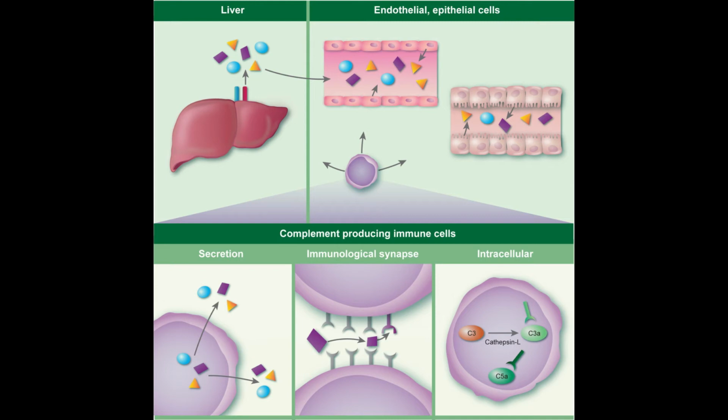The test involves a two-stage process: a test system with antigen and antibody, one of which is unknown, and an indicator system consisting of sheep red blood cells coated with hemolysin, which will lyse in the presence of complement. To destroy any complement present, patient serum must be heated to 56 degrees Celsius for 30 minutes prior to testing. Then dilutions of the serum are combined with known antigen and a measured amount of guinea pig complement. Guinea pig complement can be used for testing because complement is not species specific.